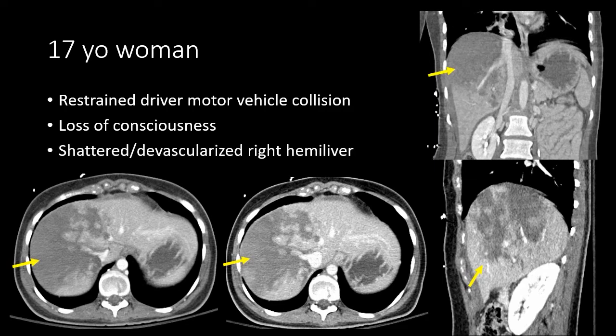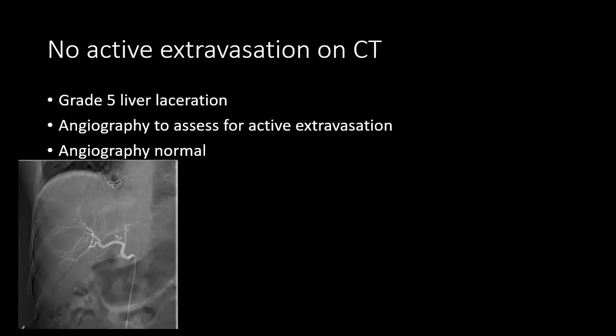This is again a very high grade injury — a shattered or devascularized liver with parenchymal disruption and central venous involvement, classified as a grade five liver laceration. Due to the extent of parenchymal disruption, this patient was sent to angiography to assess for active extravasation that may not have been detected on CT. The angiography was normal and the patient did not require operative management.